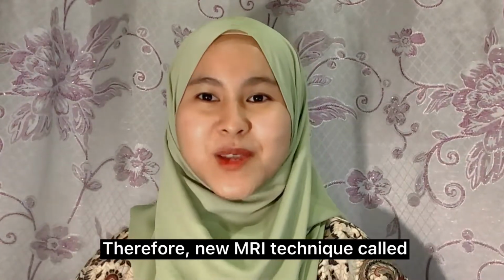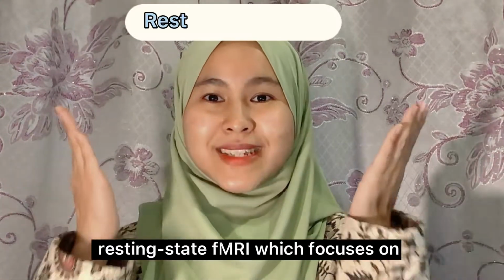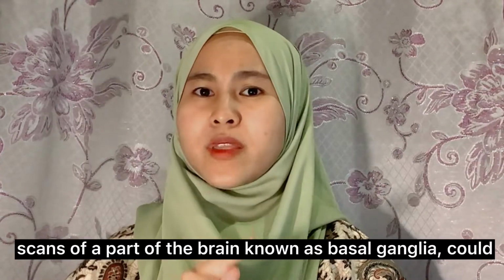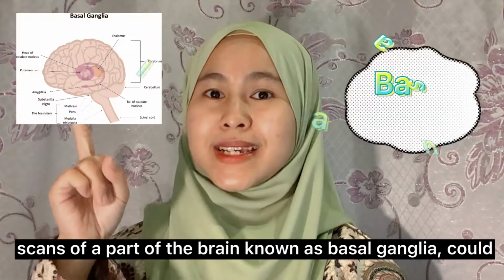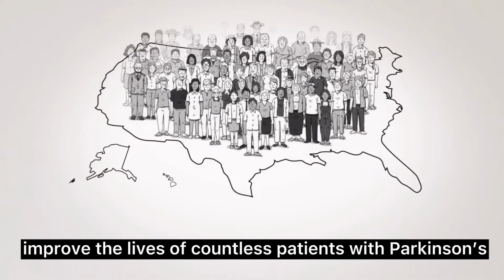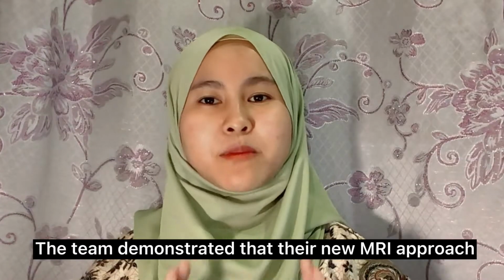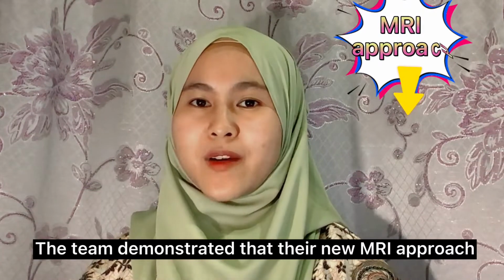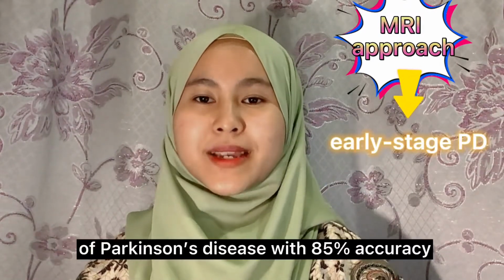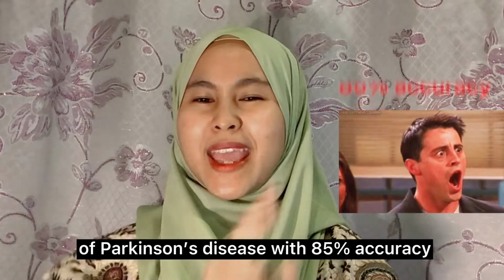Therefore, a new MRI technique called resting state fMRI, which focuses on scanning a part of the brain known as basal ganglia, could improve the lives of countless patients with Parkinson. The team demonstrated that their new MRI approach can detect people who have early stage Parkinson disease with 85% accuracy.